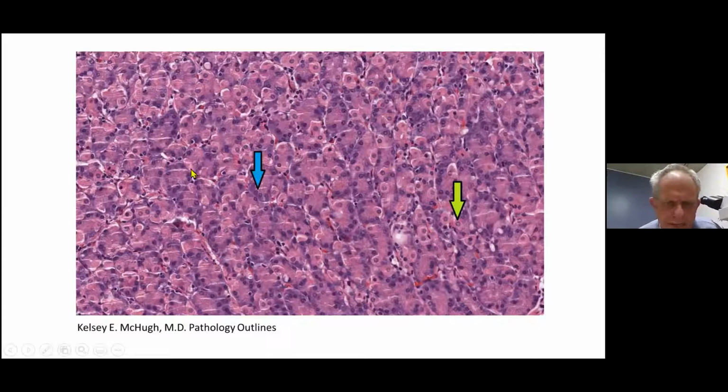But the point I would like to make in this particular photograph is to show you that the gastric glands here are closely packed to one another. In fact, you should see minimal, if any, inflammatory cells between these crypts. If you see inflammatory cells, and sometimes it's quite difficult, there could be an argument to be made that there might be a few lymphocytes there.